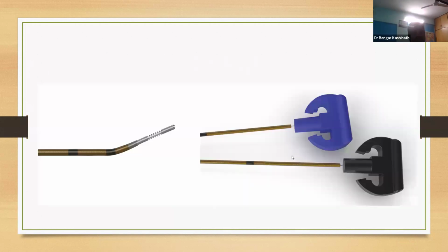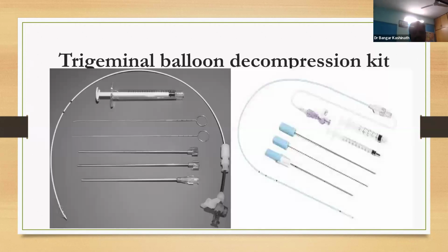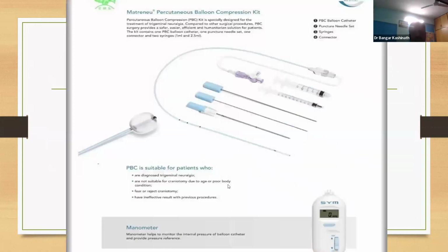Right? So, the Racz catheter. Have you seen the trigeminal balloon decompression kits? No, sir. No problem. If you have not seen it, that is absolutely fine. Nothing to worry about. So this kit comes with a balloon catheter.